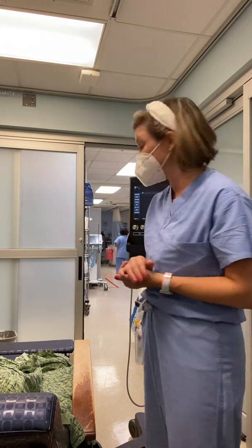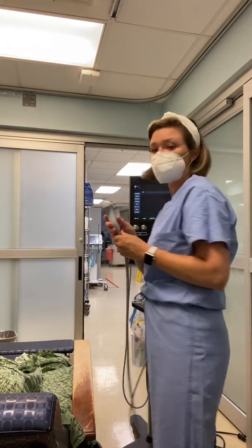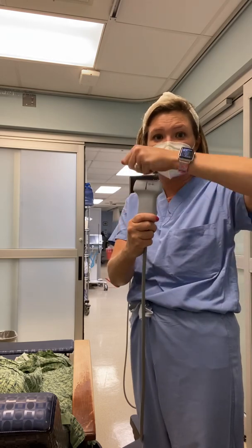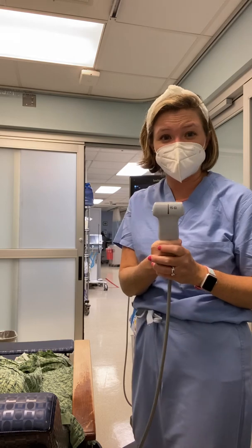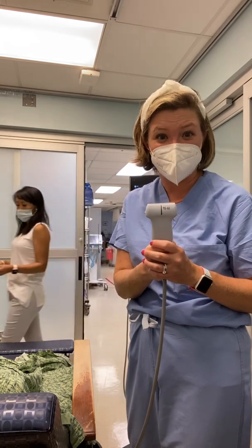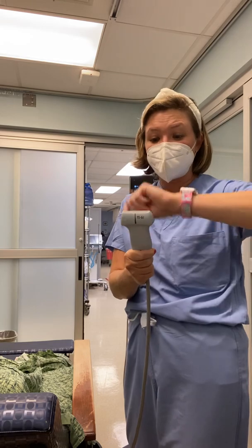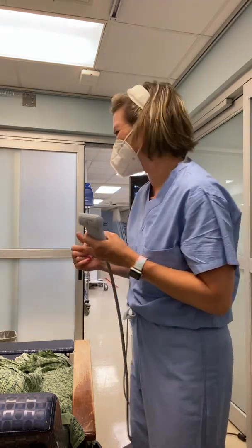The last step for the nurse is to prepare the probe. You will be using most times the linear probe, which is the straight edge, and you will simply apply a Tegaderm over the probe itself. A couple of our providers like a thin layer of ultrasound gel underneath that Tegaderm, and that's indicated on our sterile gloves sheet located in the PACU and in the inpatient holding area. Once the Tegaderm is applied, it's snug. I can actually show you guys, my assistant's here.